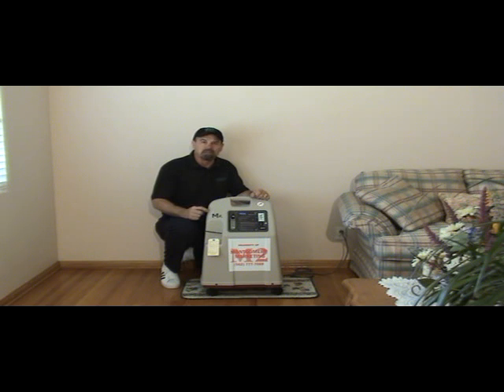The advantage of a concentrator is that it is a much safer, much more efficient way to deliver it. Don't have to worry about refilling bottles or anything like that. So it's the best and most efficient and safest way to deliver oxygen to a home setting.